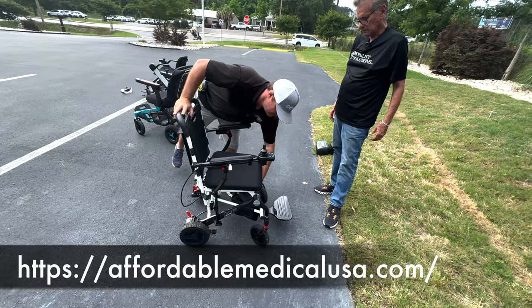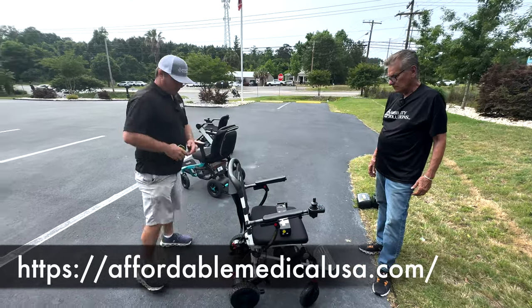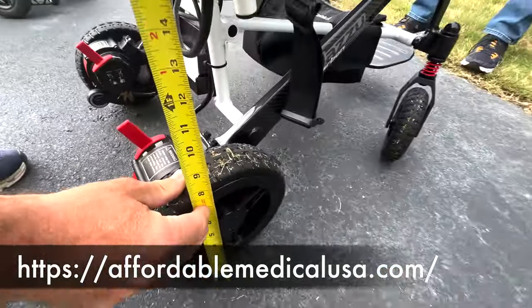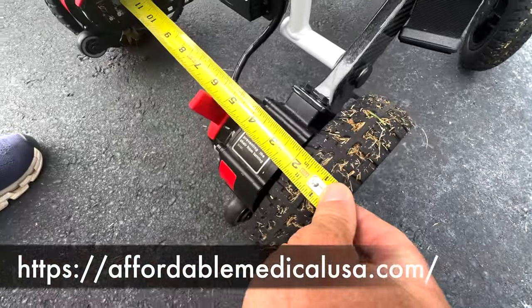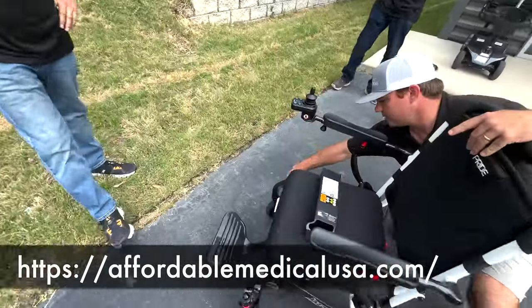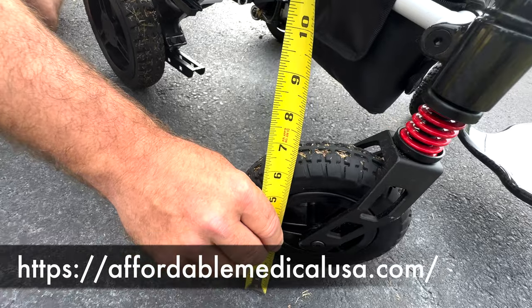Was the battery in on that? Battery was even in on that. So you can reduce that weight by taking this out. It's like 4 pounds. Overall width, 23 inches. Height of the tire, about 8. Across the tire width, about 2. So about the same size tires as the caster tires on that. And then up at the front, a little bit less than two. And then the height, it's about right about there, about 6.5.